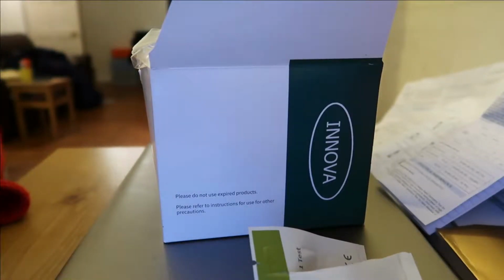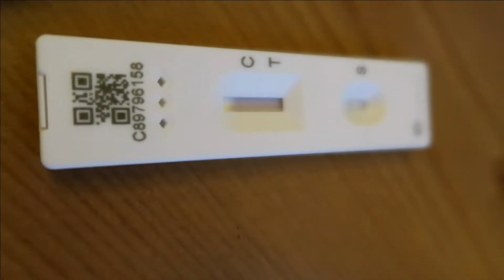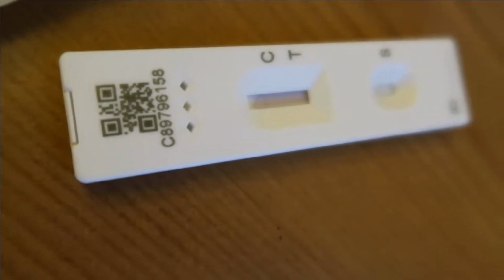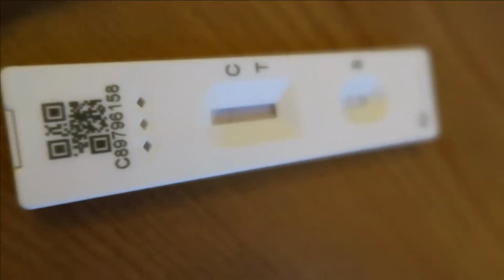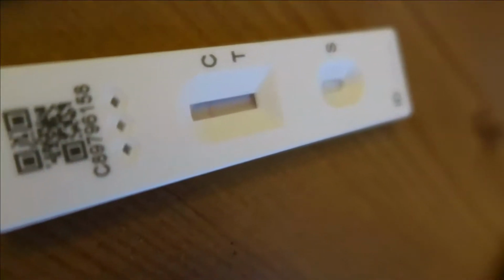So the time is 8:30 now, so I will time it for 20 to 30 minutes. As you can see, it's already starting to read, and I will tell you later what the result is.